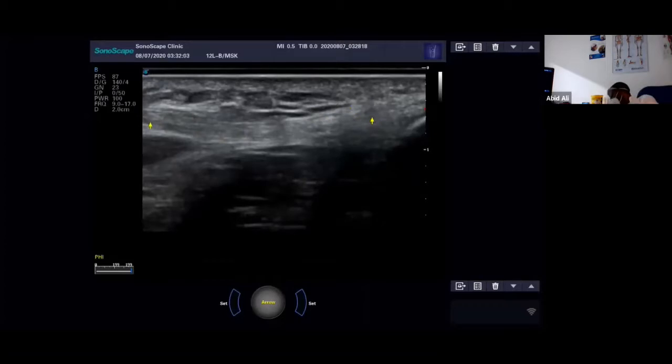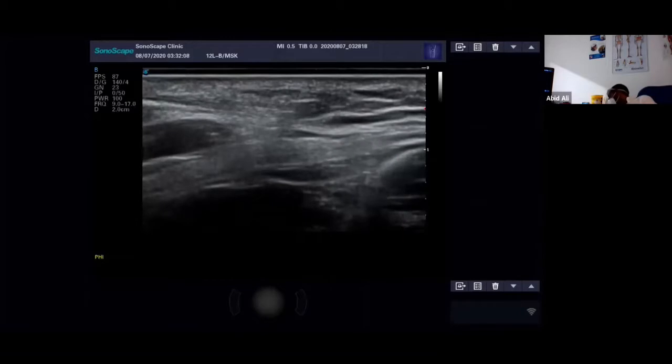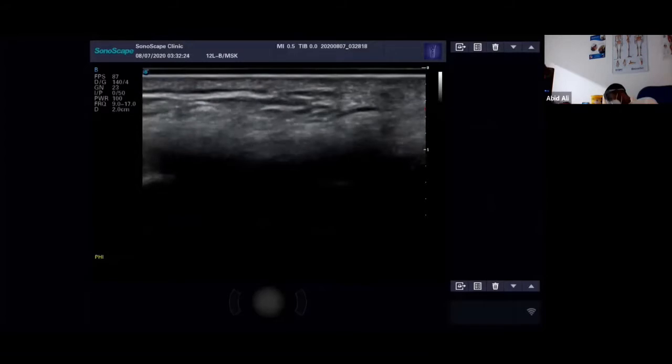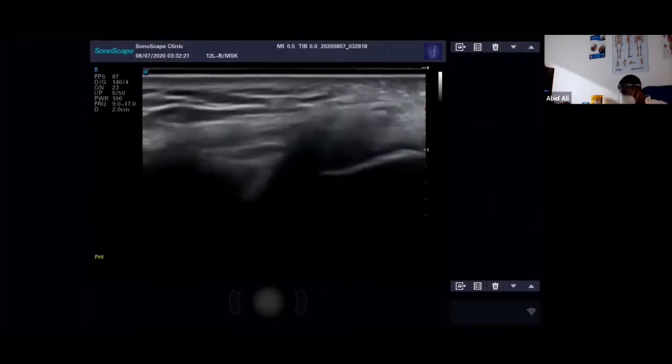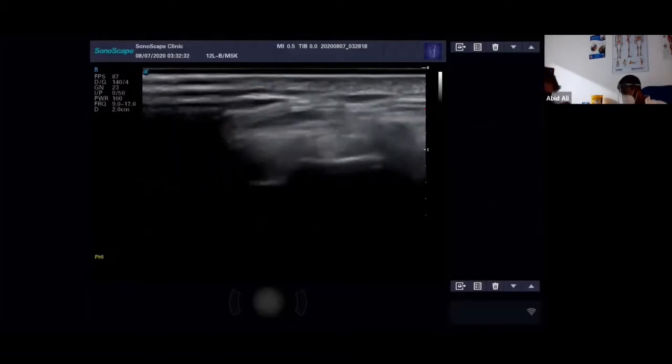And that's the lateral there. Now for the biceps femoris, I'll take you back this way. So for the lateral, obviously you're going to be on the fibula, but pointing back towards the femur here. For the biceps femoris, you're going to angle back because that's where the muscle goes posteriorly. So like on the Z, yeah, we're angling back that way. So that's the collateral, that's the ITB, that's the biceps femoris.